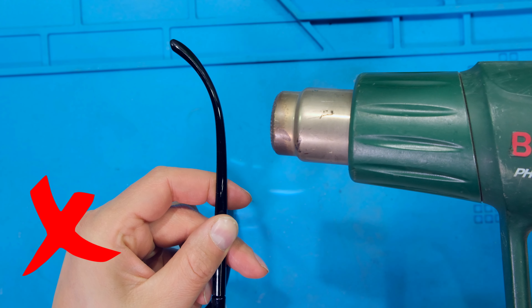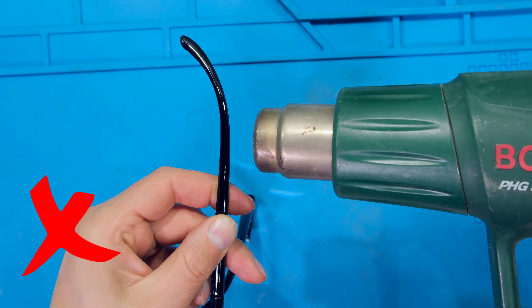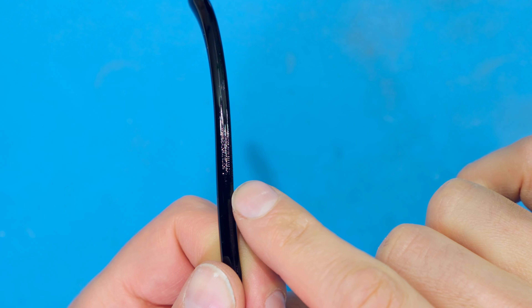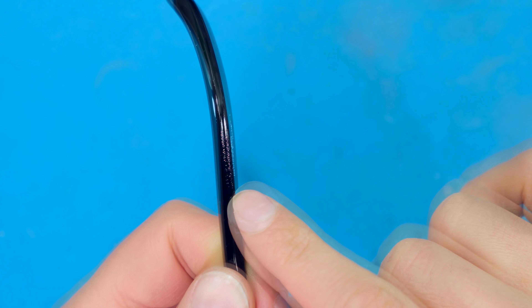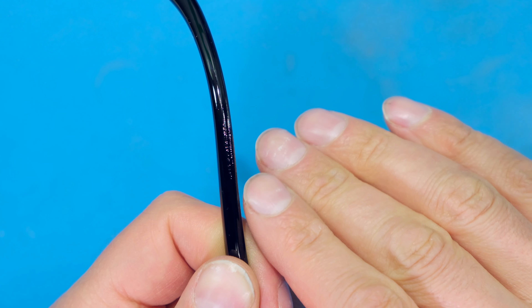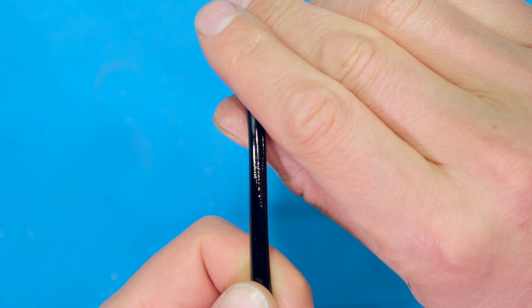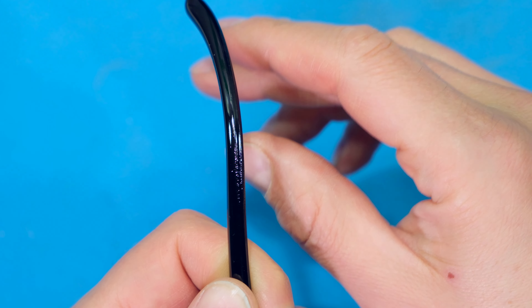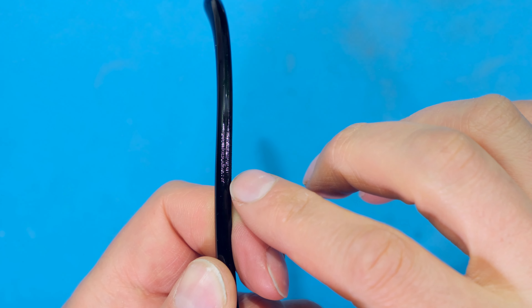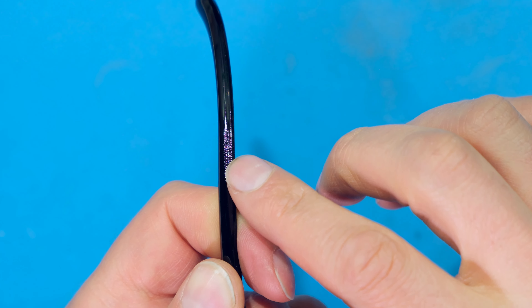The next tip: do not hold the heat gun in one place like this — it will deform the plastic. Look at that bubbling — that means I held the heat source there for too long. You don't need to hold it there for long; that is why I heat it up a little bit and try to bend it, heat it up a little bit and try to bend it. Different plastics require different heat — in this case just a little bit of heat and there it bubbles.